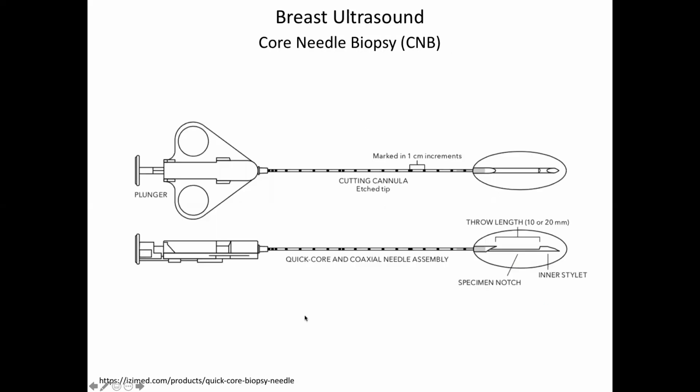And then this device, and there are hundreds of these on the market now, made by many different companies. And you can imagine that a needle biopsy device, because it's kind of low tech, the barrier to entry to this business is not terribly high, right? I mean, if you can make a really nice cannula, and you have these markers on here that appear in ultrasound and X-ray. You have the mechanics of a trigger system that when you get to the target, you just pull the trigger and it takes out a sample without any delay, so that you're not moving around.